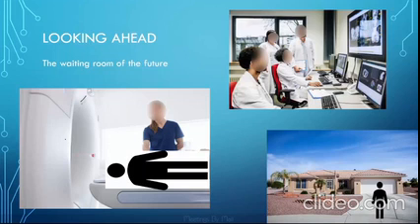So let's begin this section with a discussion of the waiting room of the future. The current standard for patients presenting for routine exams is that a patient will present to a hospital or imaging center, where the imaging exam will be performed, the images will be acquired and processed, and they will be sent to a work list. Depending on the volume and the turnaround time for a particular practice, a routine exam may be on the work list for hours or even days before it's interpreted.